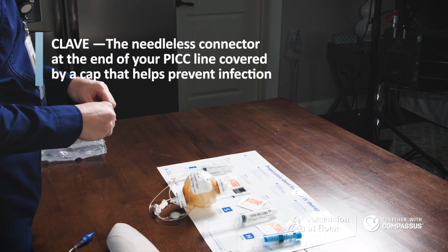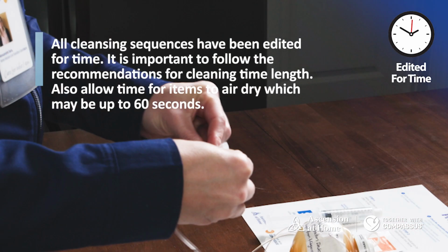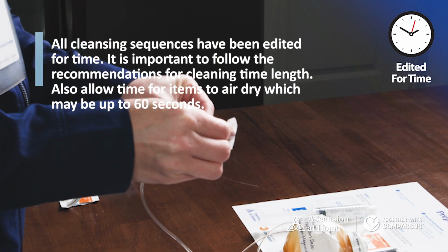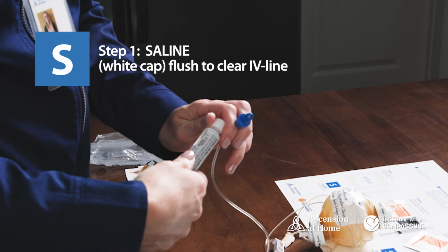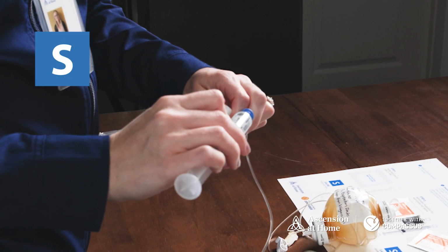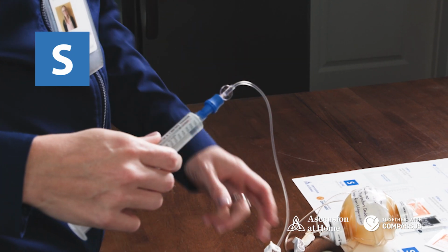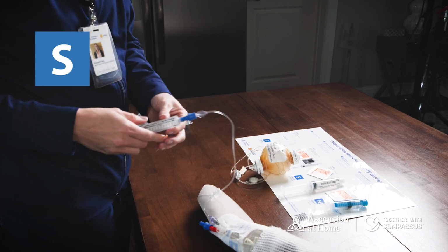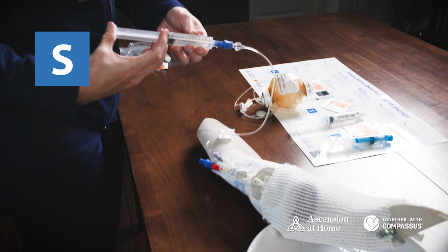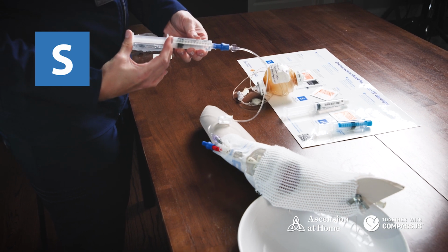Scrub the clave with an alcohol wipe for 15 to 30 seconds and allow to air dry. Remove the cap from the saline syringe. Attach the saline syringe to the clave by using a push and clockwise twisting motion. Once it is connected, open the clamp on the extension tubing and the PICC line if present. Flush the line with saline using a pulse or a push-pause method.